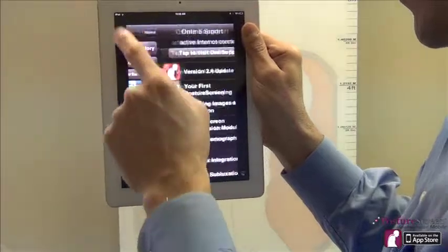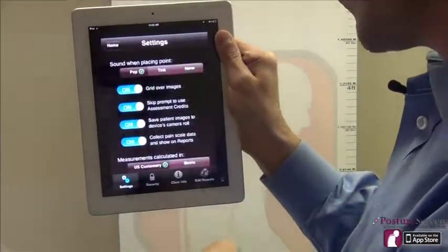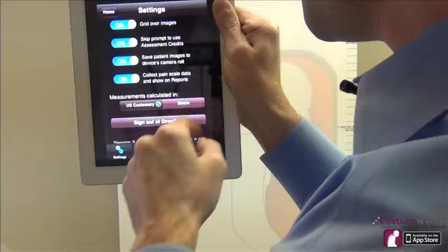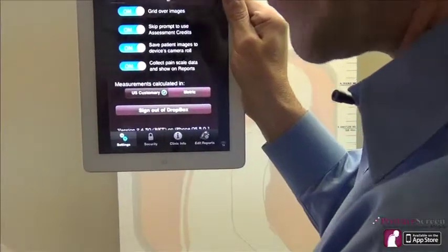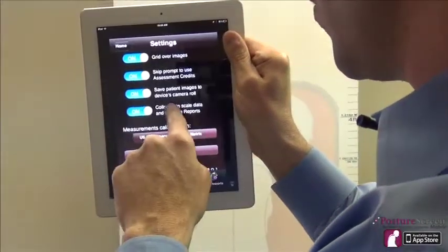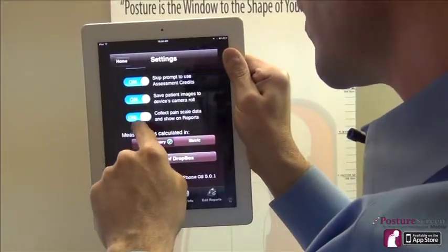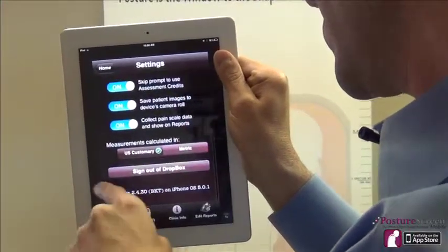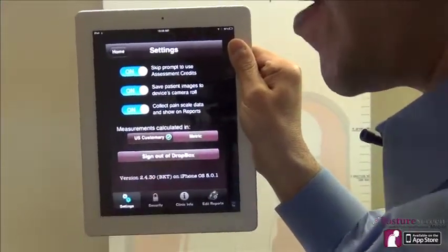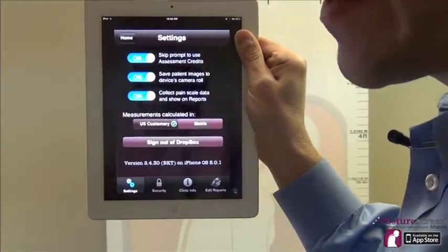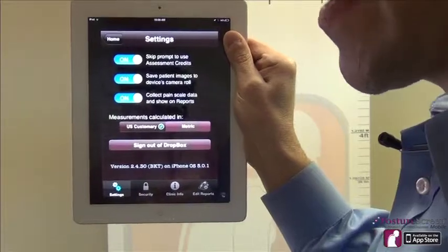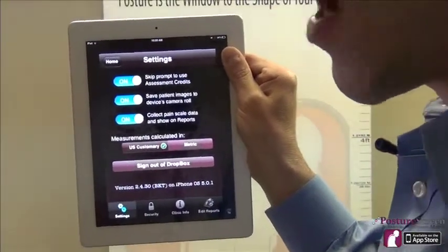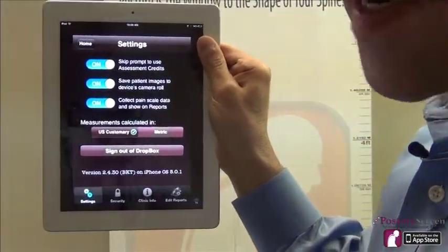One last thing I wanted to show you: if you don't want the pain scales to show, here's the Collect Pain Data toggle — you can turn that on or off. Also, we've fixed a Dropbox bug. They gave us some new updated code, so now when you sign into Dropbox, you should not get any errors.